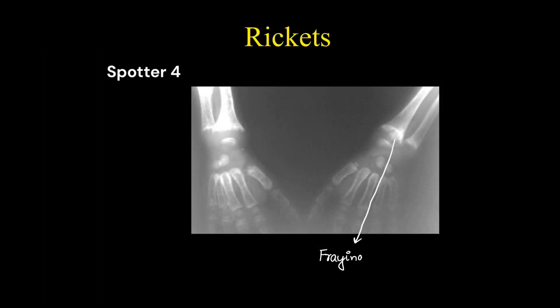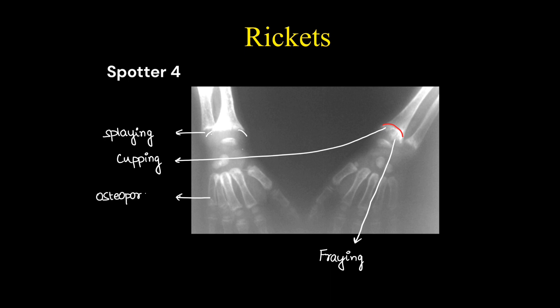This is a case of rickets. Here you can see fraying, that is brush-like appearance, splaying, widening of metaphysis, cupping, and osteoporosis.